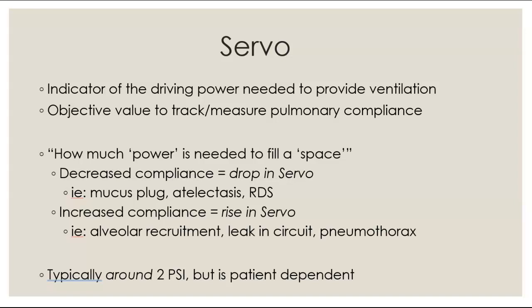And I have visuals also for this. Typically we want this around 2 PSI, but it is patient dependent. I have some kids with just trash lungs that I'm happy to chill around 3. I have some kids that are itty bitty preemies that I hang around 1.5. So it's finding what is normal for your baby, but typically around 2 PSI is where we want to be.